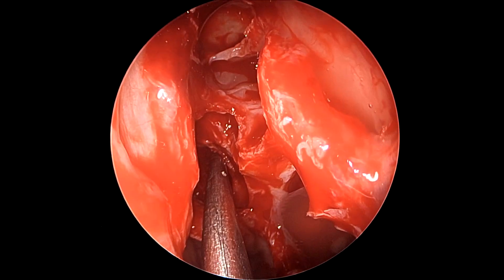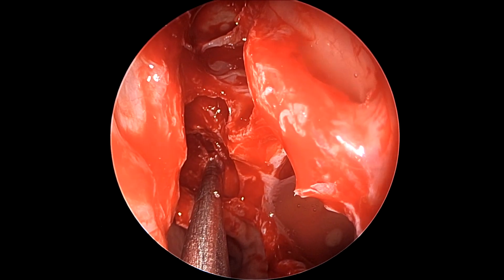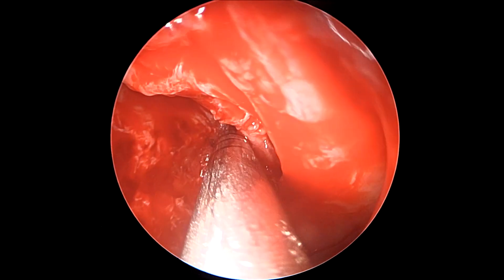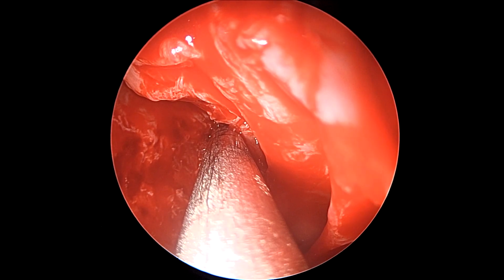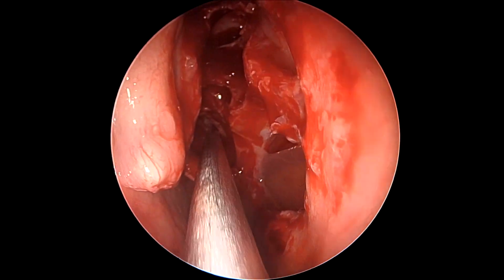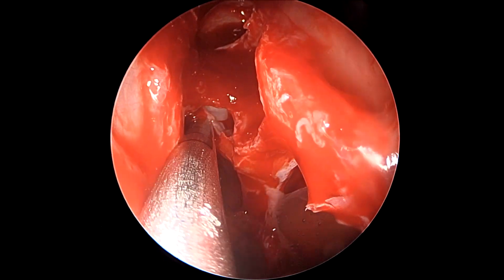So we see here now that the ethmoidal complex has been opened, the sphenoid has been opened, which is in line with the superior maxillary wall, like this. The ostium is slightly lateral because of the oblique intersphenoid septum, and that has to be kept more in mind. Like in this case, the sphenoid ostium is located lateral, not along the septum.